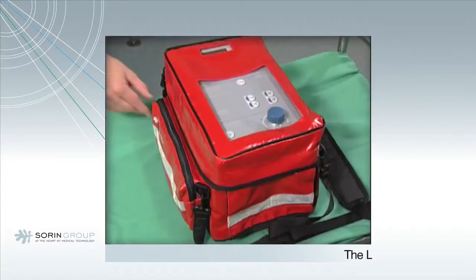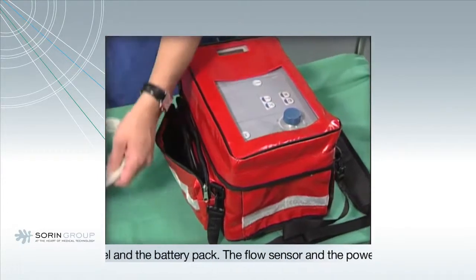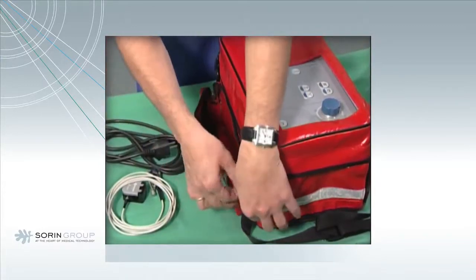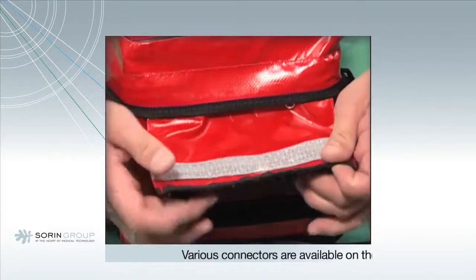The LifeBox itself contains the control panel and the battery pack. The flow sensor and the power cable are stored in a pocket on the side of the box. Various connectors are available on the front of the LifeBox.